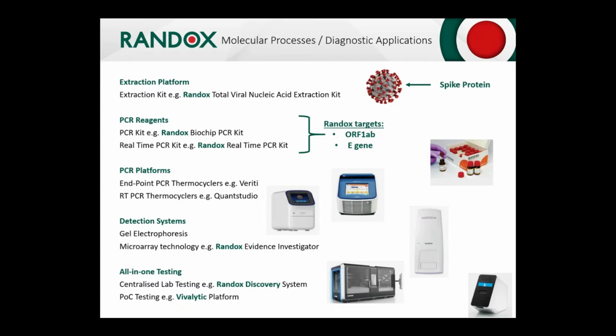So there were multiple different genes and open reading frames identified within the viral genome of SARS-CoV-2. For example, you had your spike protein, your N protein, your E gene, as well as your ORF genomic regions. So each diagnostic company really came to design their own specific test. Randox spent a lot of time and ensured that we identified areas that were conserved, specific, but also ones that would future-proof the assay.